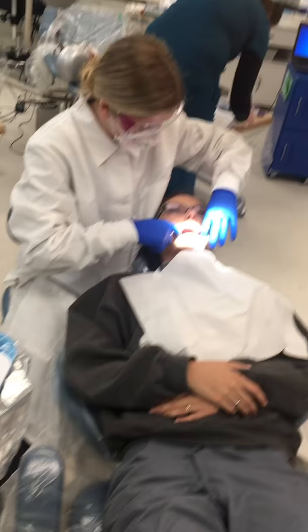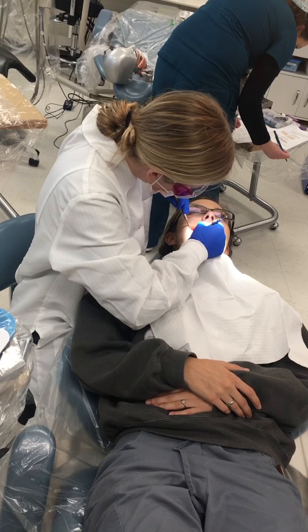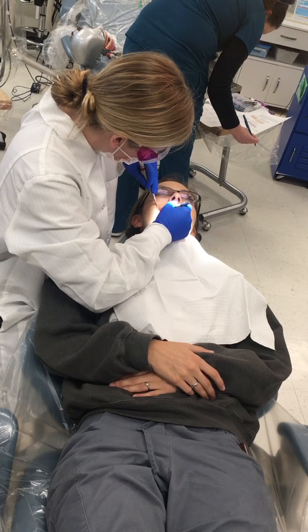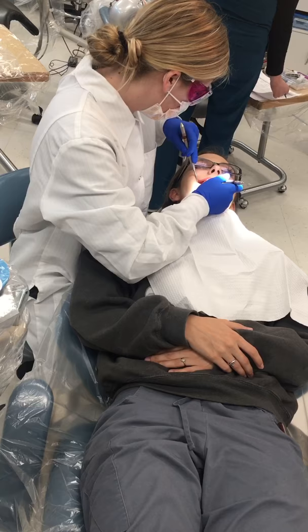Go ahead and take a look — the redness seems like it's gone away and it's nice and pink, so that's great. Now let's go through and take some measurements and see if those probe readings have come down. 3-2-3, 3-2-4, 4-2-3, 3-2-4, 3-2-3, 3-1-3, 3-1-3. There's just bleeding on the distal of 3. That looks really good — nice job!